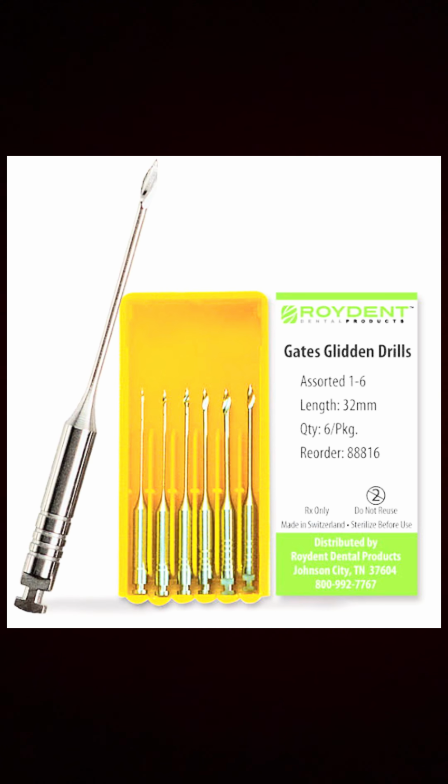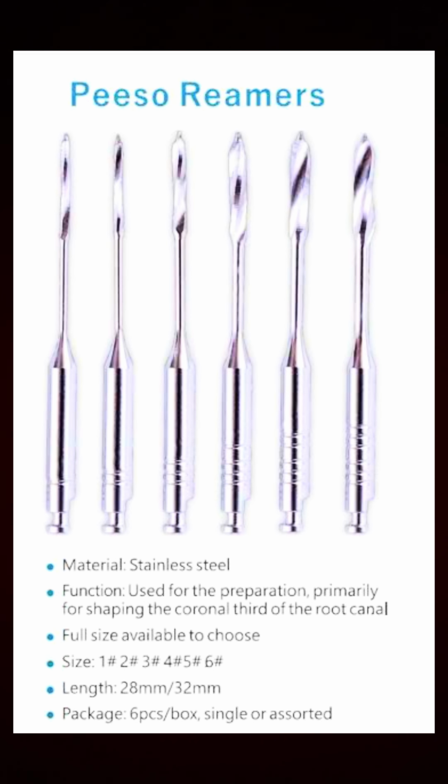Next one is Group 3, ultrasonic and sonic instruments. Both the sonic and ultrasonic instruments have been reported to cause transportation of the canal if used carelessly. Currently, both sonic and ultrasonic devices are not indicated for shaping of the canal. They are more indicated for cleaning application inside the root canal.